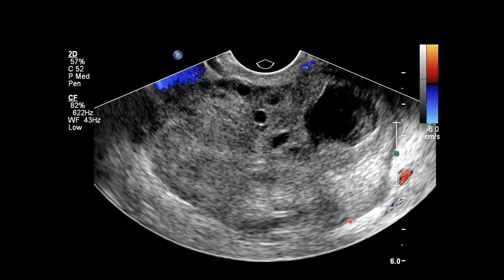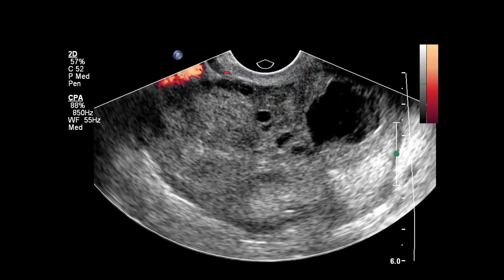When we add color Doppler, we don't see any flow, which is very concerning for torsion. But we do see these peripherally displaced follicles, and notice how they have a thick echogenic rim. That's known as the follicular ring sign, something that we see occasionally within a torsed ovary but don't typically see within a normal ovary.